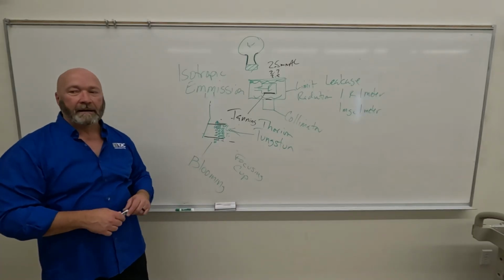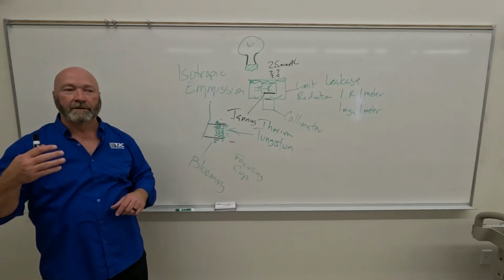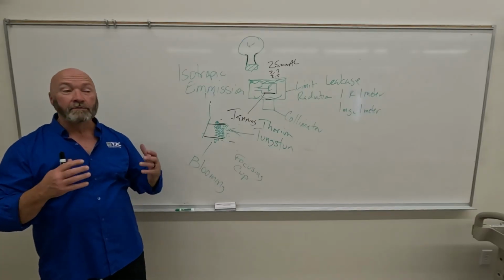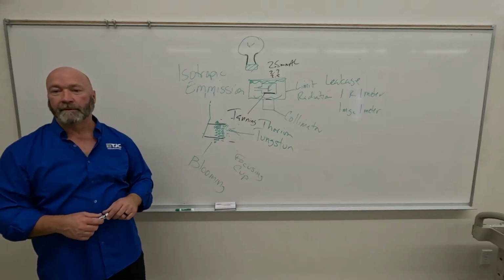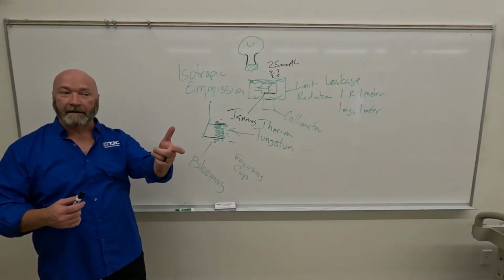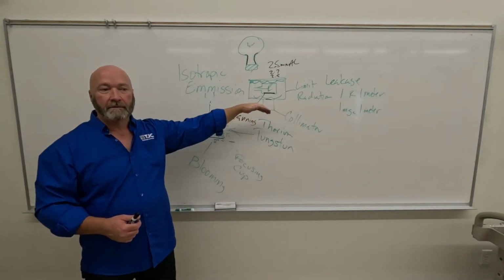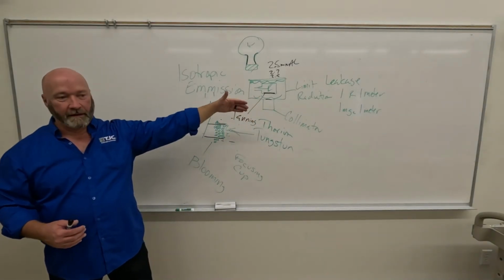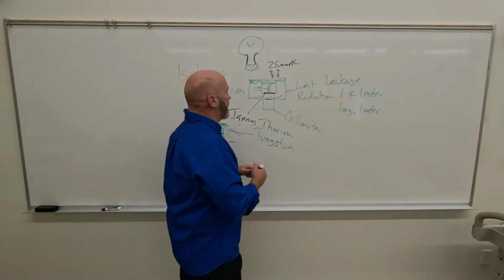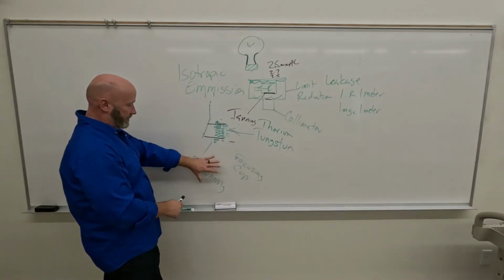So again, back to electrodynamics. Is glass a good insulator, or is it a good conductor? It's an insulator, right. Now you coat it with metal. What does it become? It becomes a conductor. It's not a semiconductor because now it's coated with metal, right? And the metal's fully a conductor, right? So now our electrons, okay, can I get rid of some of this stuff?